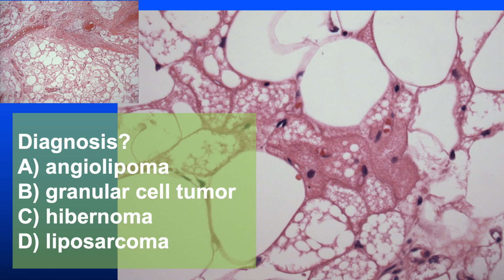Histologically distinctive tumors, even if they're very rare, tend to make good test questions. So seasoned residents, please pause and diagnose.